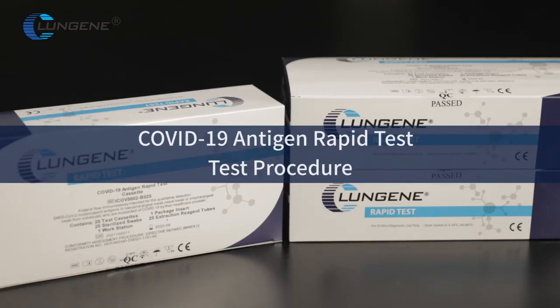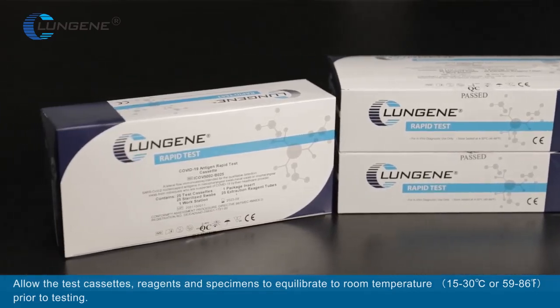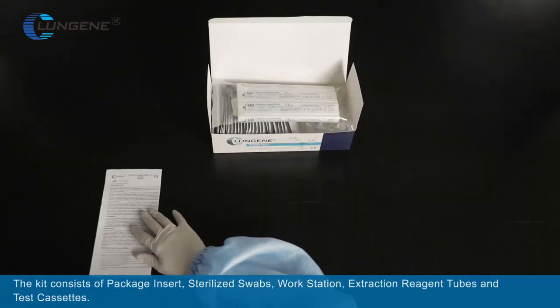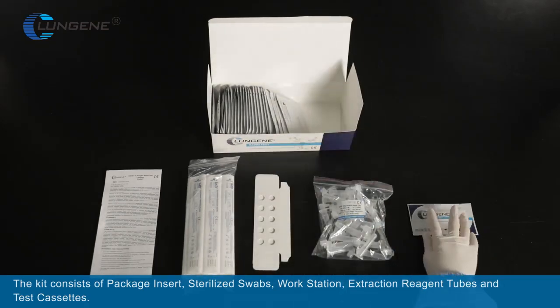COVID-19 Antigen Rapid Test procedure. Allow the test devices, reagents, and specimens to equilibrate to room temperature prior to testing. The kit consists of package insert, sterilized swabs, workstation, extraction reagent tubes, and test cassettes.